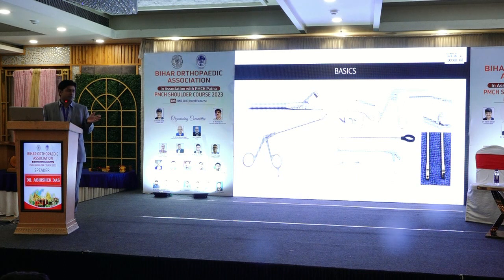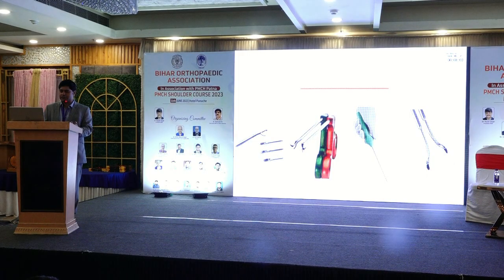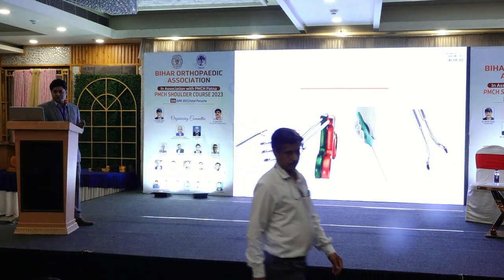Now, all of these instruments come in straight, right, left, up biter, down biter as per your convenience. There are lots of sutures, and shoulder surgery is equivalent to suture management. So whether you're doing Bankart surgery or rotator cuff surgery, you can start off with something like this, which is a clever hook or a rhino from the other company, and they have a nice tip with which you can pierce the tissue and then retrieve your suture.